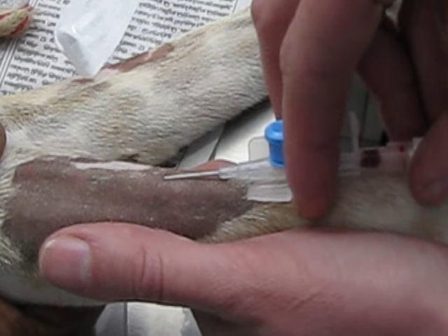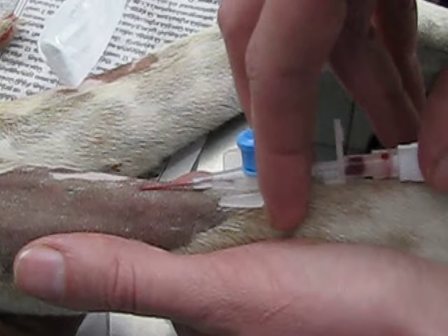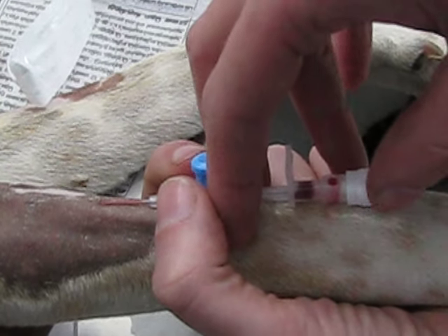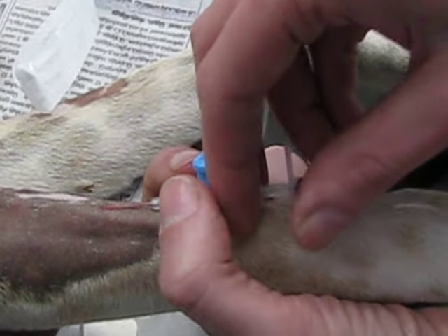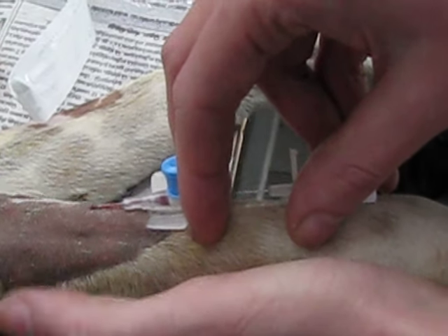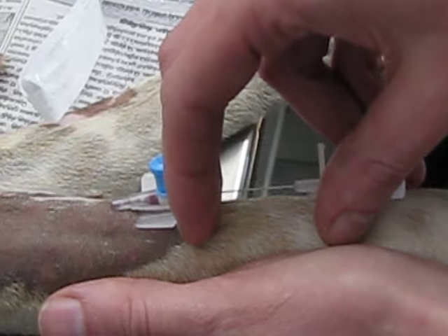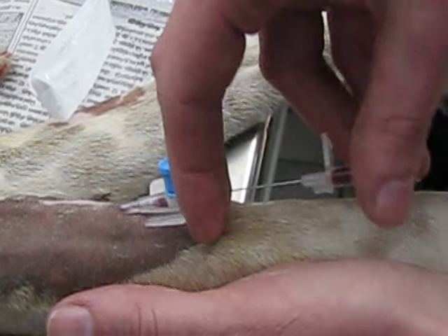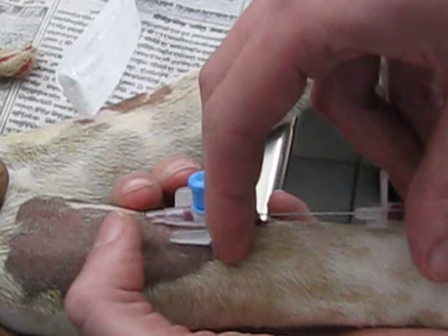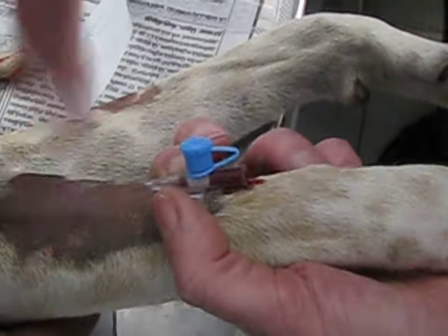Once the conus is filled nicely with blood, I pull out the needle slightly — a couple of millimeters — with my thumb and my ring finger. Once this part fills with blood, I can pull the catheter in, still holding the needle in place. Only once the catheter is fully inside do I take out the needle.